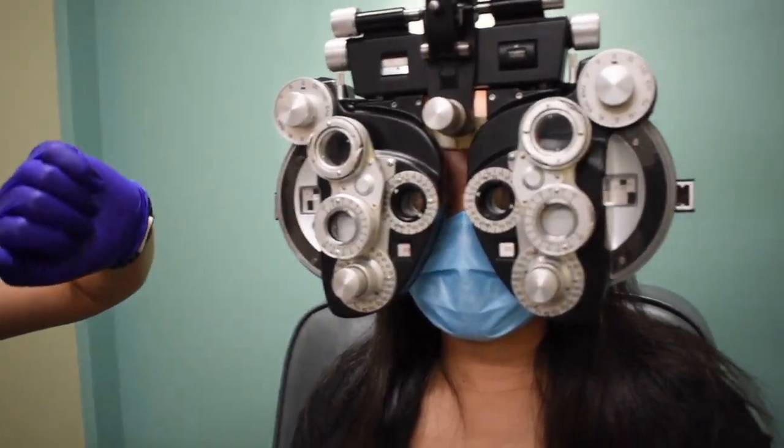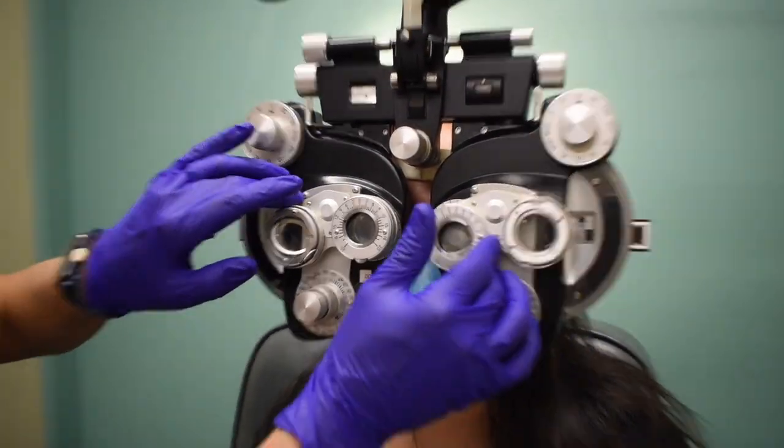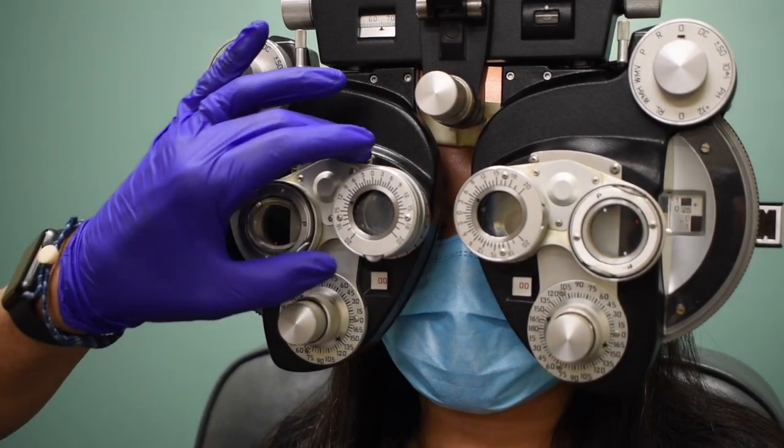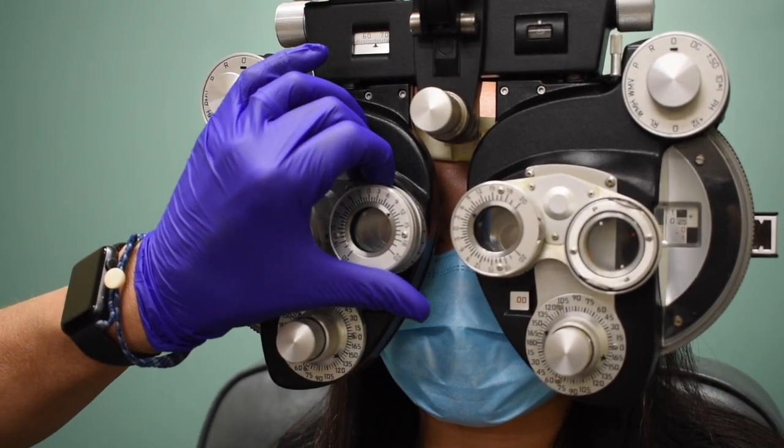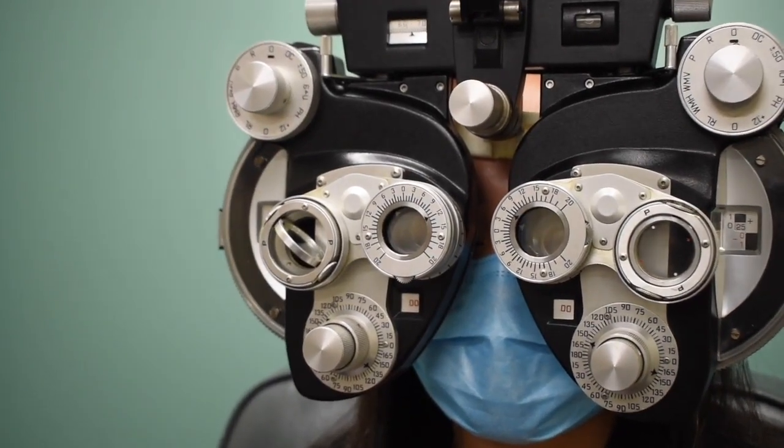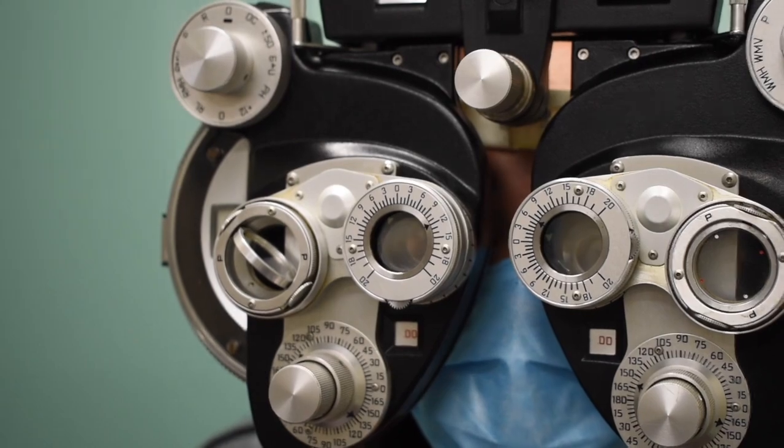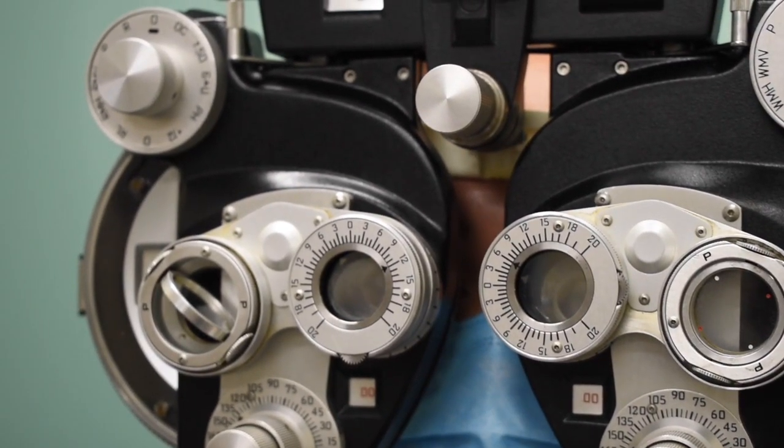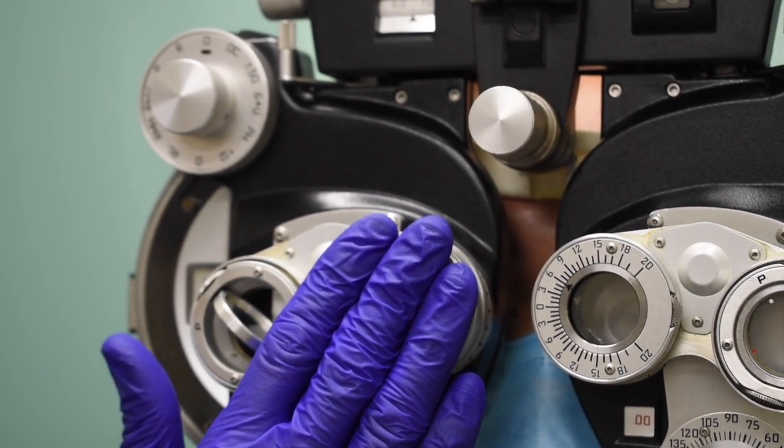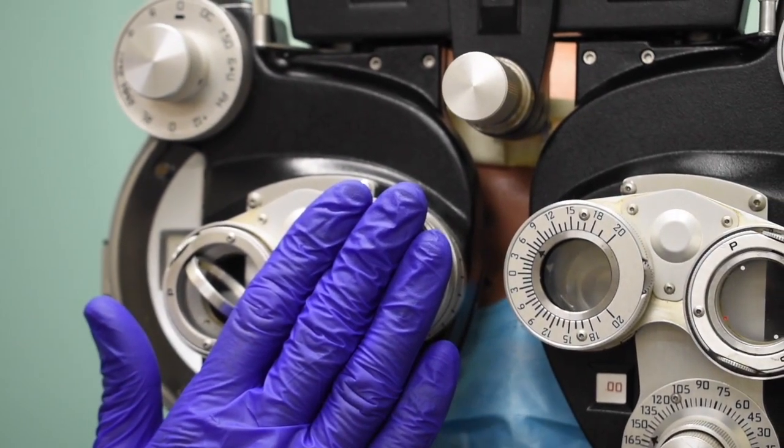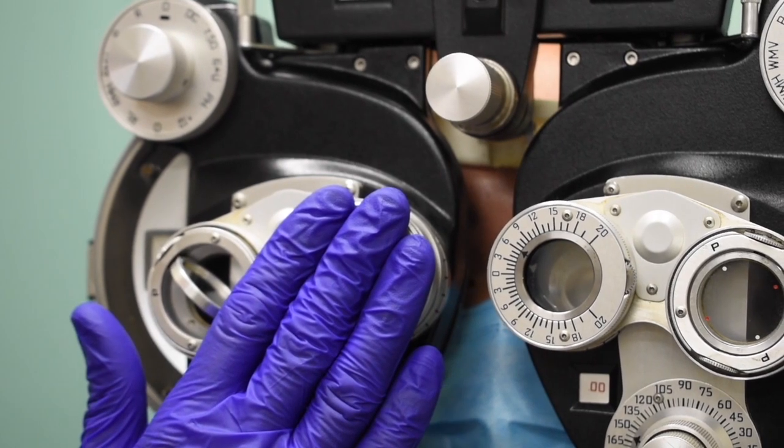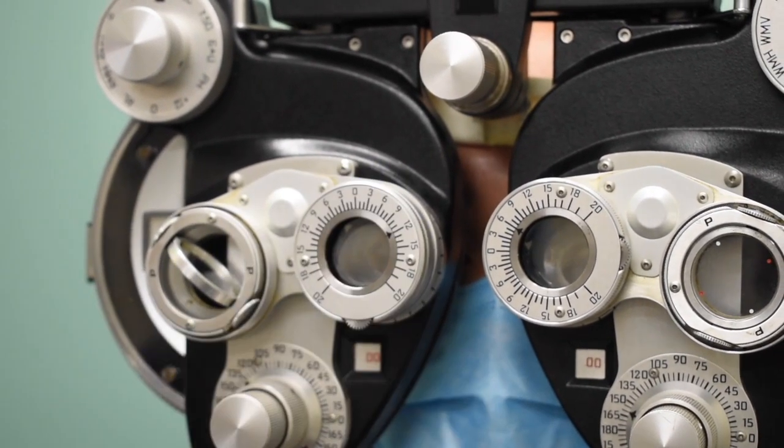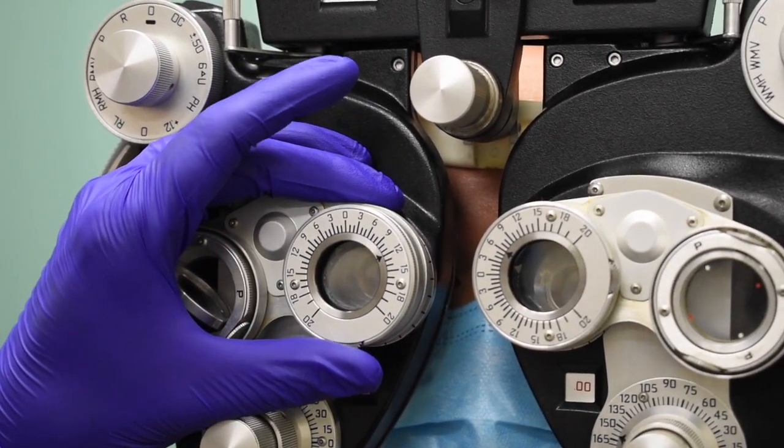So the next step is I'm going to go ahead and put my prisms in place. I'm going to have you close your eyes, Phoebe, if you don't mind. I'm going to rotate them in, get them set up. So I need to rotate this so I've got 6 base up OS and 12 base in OD. And I'm going to have you go ahead and open your eyes now, Phoebe. When you look over there, do you see two eye charts, two letter Ts? Yes. When I do this, which one disappears, the one on the upper right or the one on the lower left? The upper right. Great. I want you to stay focused on that one right there, the one on the lower left. Keep it as clear as you can. Tell me when they line up vertically like buttons on a shirt.